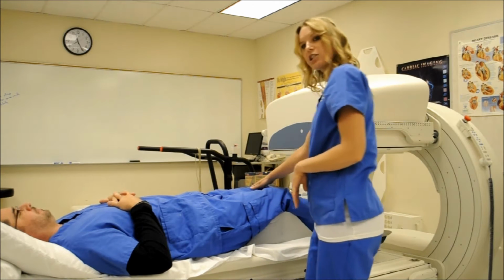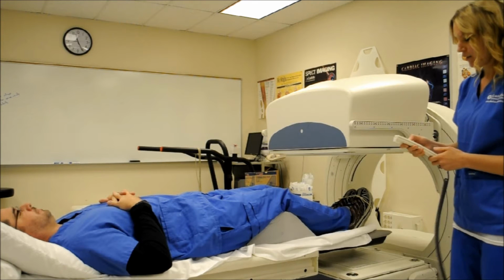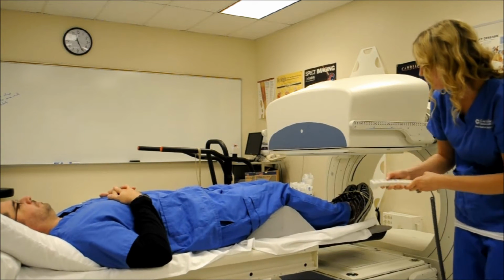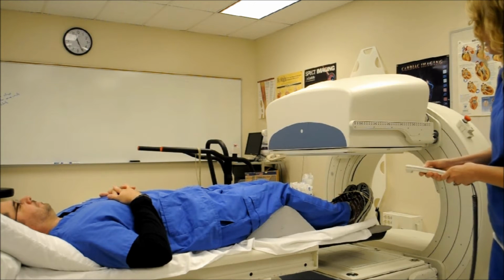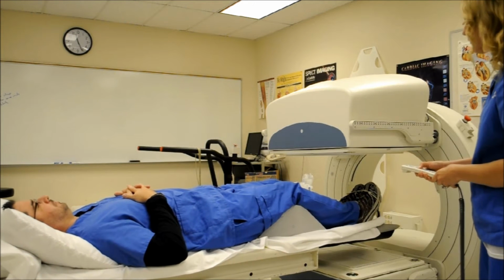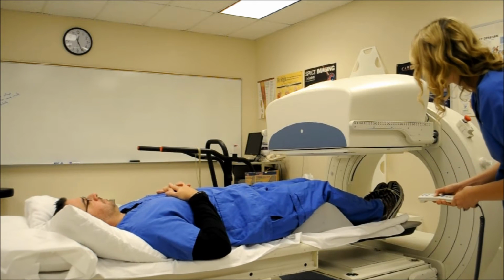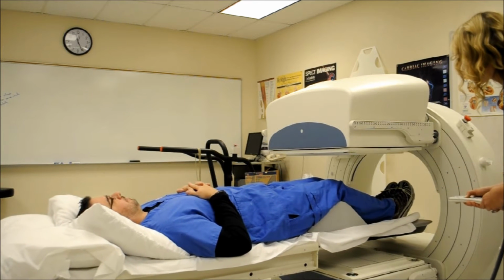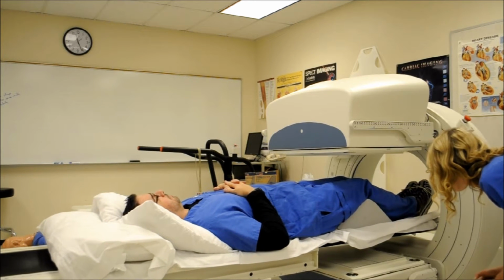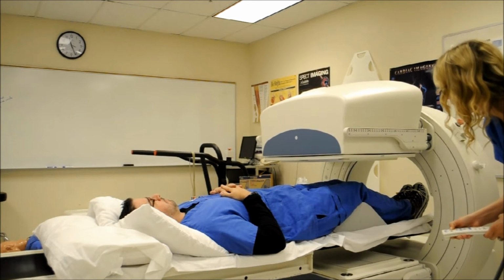So I'm going to position Rusty nice and center with the area of interest, which is his knee, in the field of view. I want to bring the cameras in nice and close to get that good image resolution.